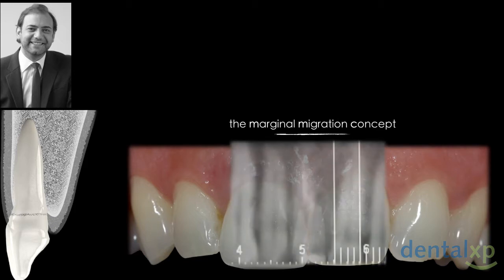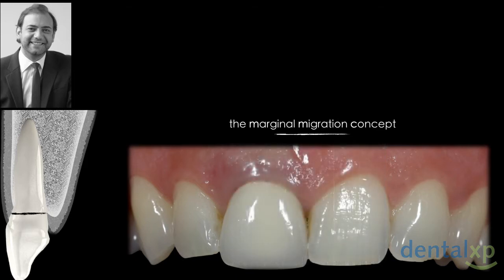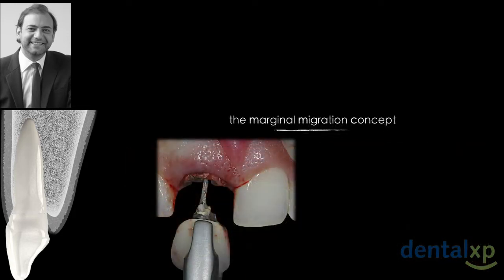So this central incisor is hopeless. I'm sure Francesco will agree with me. My dad is also an endodontist, so no chance for me to extract teeth which are not to be extracted. This tooth has to be extracted. It has a fracture on the middle aspect of the root. This is how we proceed.